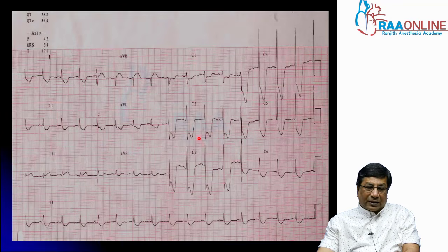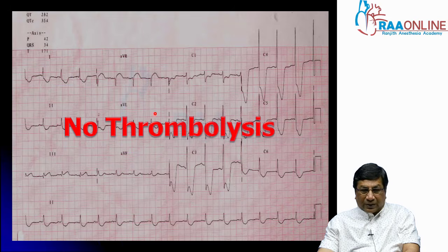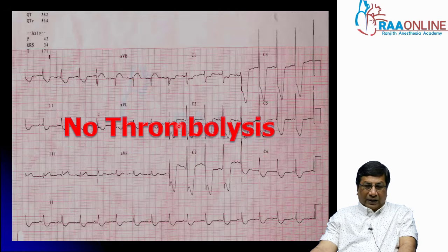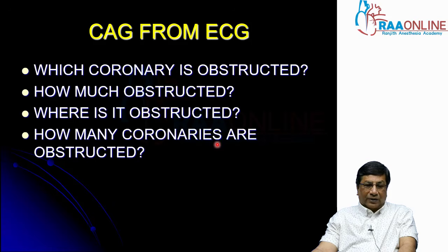Whereas look at this patient, who is coming with acute chest pain once again. He has significant ST segment depression. So this becomes a non-ST elevation ACS. The most important thing here is that you don't thrombolyze this patient. Depending upon the risk of the non-ST elevation MI, if the patient is a high-risk patient like this, where the patient has multiple huge ST segment depressions and also ST elevation in aVR, this is a very critical occlusion. Then this patient should go for an immediate coronary angiogram. If a patient is low risk, you can treat him medically with heparin, dual antiplatelets and high-dose statins.